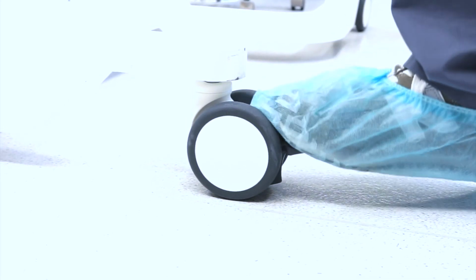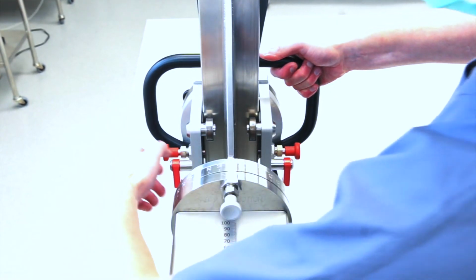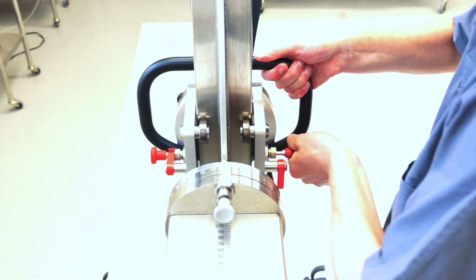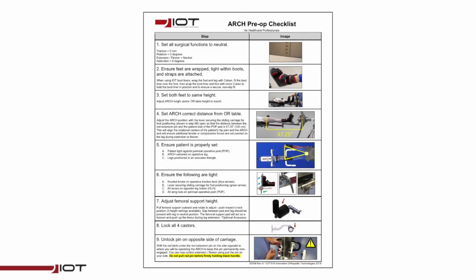Secure the arch in place by locking all four casters. The sliding carriage has locking pins on each side to hold it in place. Always firmly hold the black handle before pulling either of these pins. Pull out the pin on the non-operative side and slide the red latch under it to keep this pin disengaged. This will allow operation of the carriage from the operative side using the other pin.